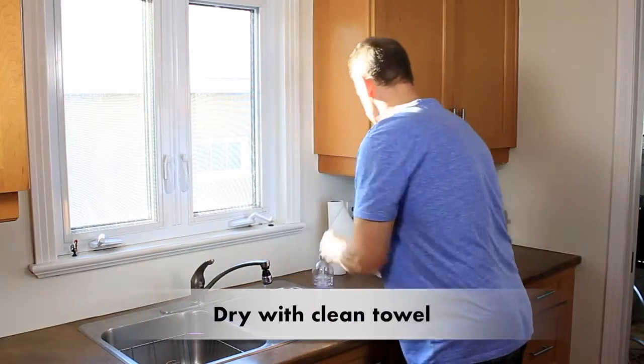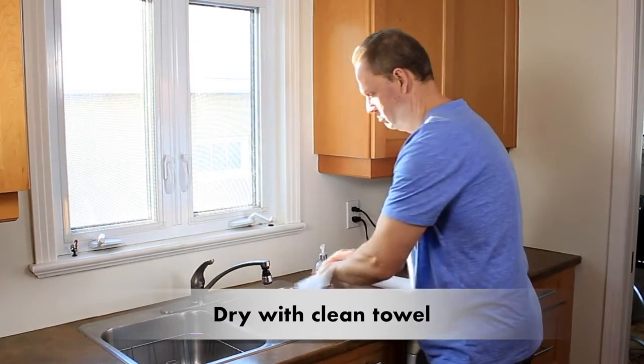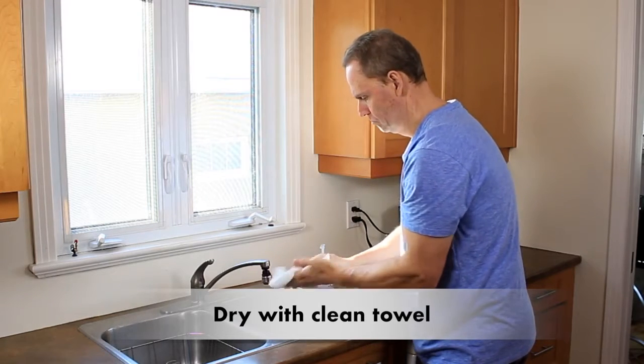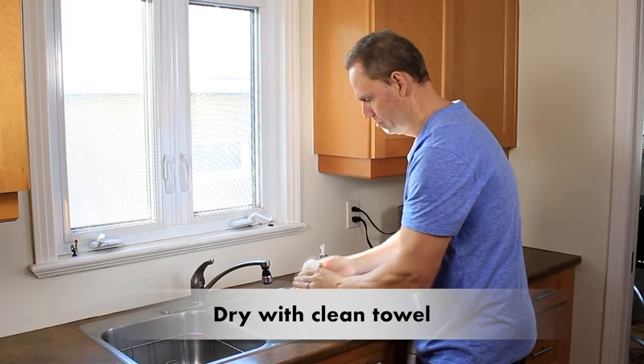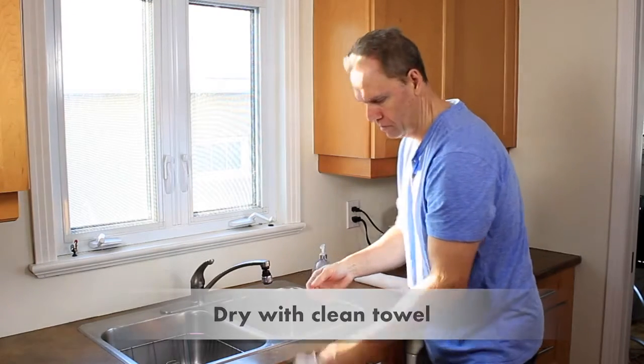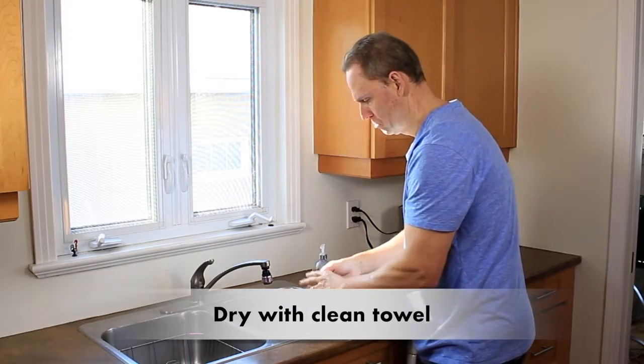He's turning the tap off with his elbow so he doesn't touch the dirty tap with his clean hands. Now make sure you use a clean towel or paper towel to dry your hands and turn the taps off. Now you need to keep your hands clean, so don't touch your face or anything else other than your supplies. You don't have to use gloves because you're working with clean hands, unless your nurse told you to.